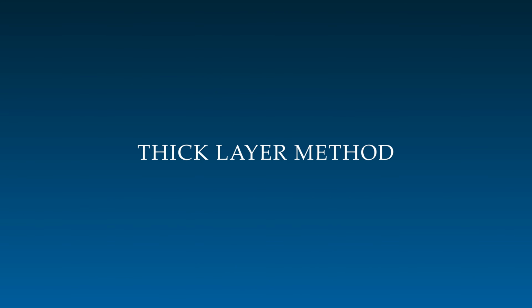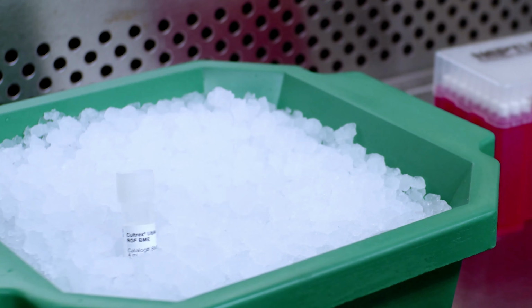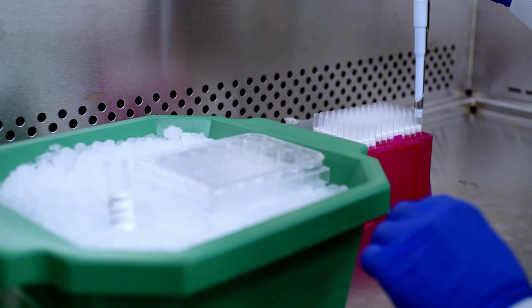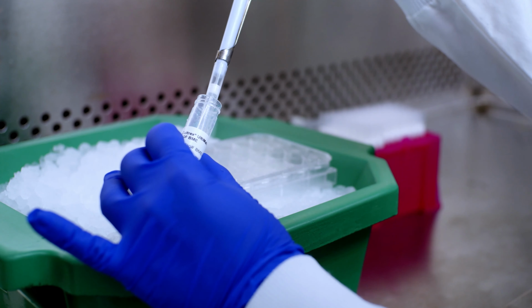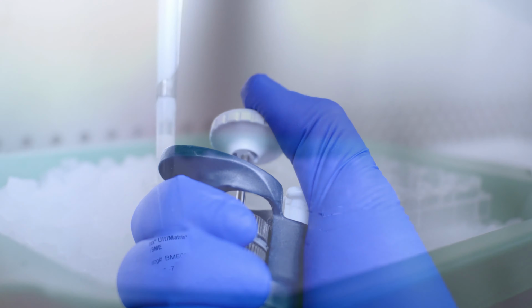The thick layer method uses undiluted Cultrex BME to promote the formation of 3D structures, including spheroids. Cells can be plated on top of the concentrated matrix or embedded within the matrix. Using cooled pipette tips, mix thawed Cultrex BME by pipetting the solution up and down. Avoid introducing bubbles during this process.